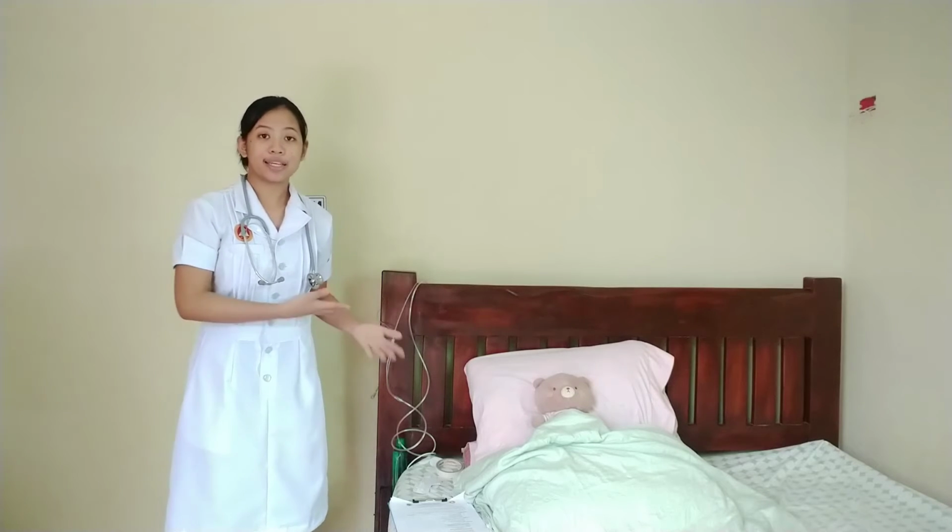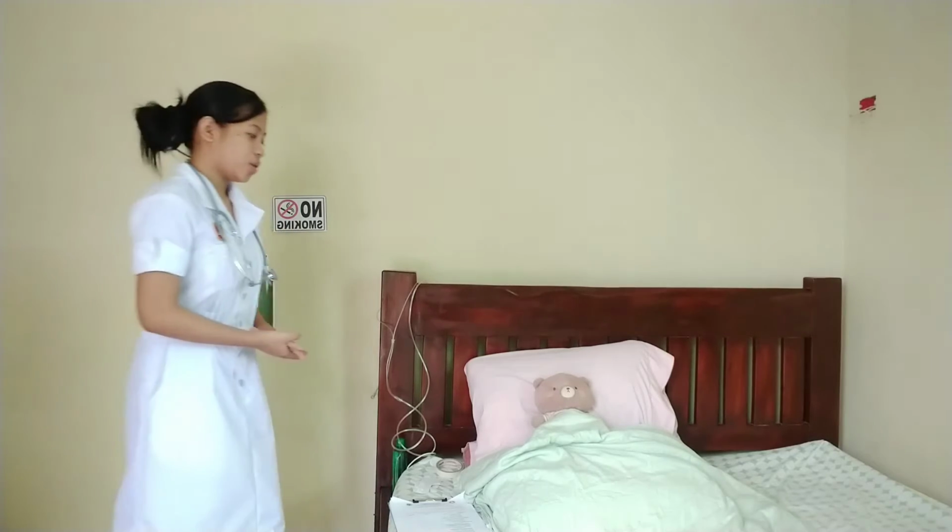And then after that, prior to doing the administration of oxygen, I will be introducing myself and identifying my patient and verifying my client's identity. Explain the procedure, why it is necessary, and how the client can cooperate during the procedure. Also, I will be explaining to the client the purposes and the benefits of oxygen therapy in planning future care for the client. So, good day, ma'am.